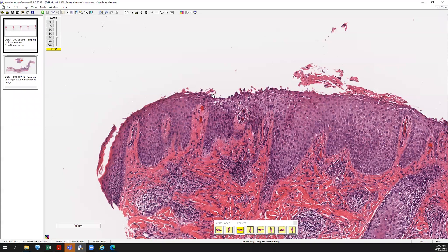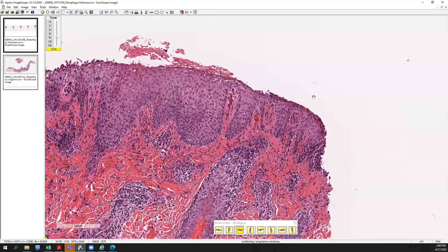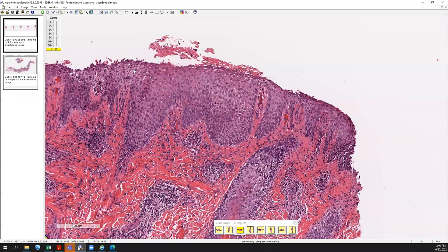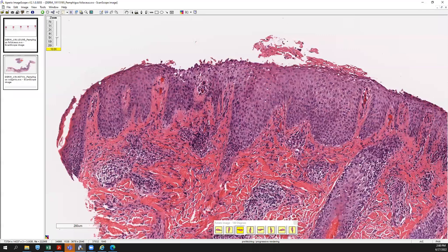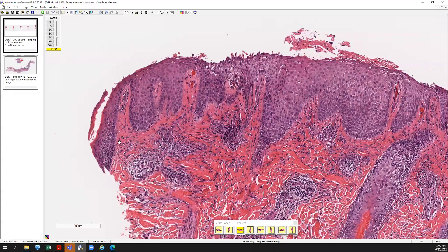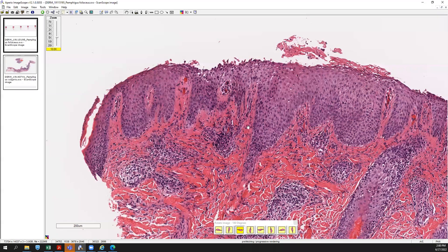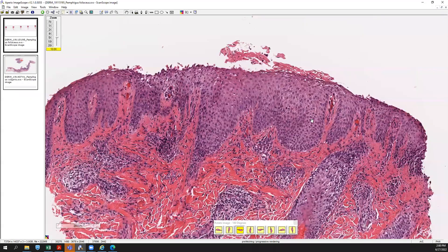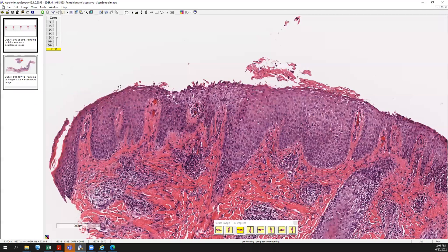You need to remember the autoantibodies targeting which antigens. Pemphigus foliaceus is typically associated with anti-desmoglein 1. On direct immunofluorescence you'll see fluorescence in between the keratinocytes, and most of the signal is going to be up where desmoglein 1 is strongly expressed, which is the superficial epidermis. You want to go perilesional when doing direct immunofluorescence — don't look for that pattern in lesional skin because it will be detached. Go perilesional and look for IgG deposition in the superficial intraepidermal region.